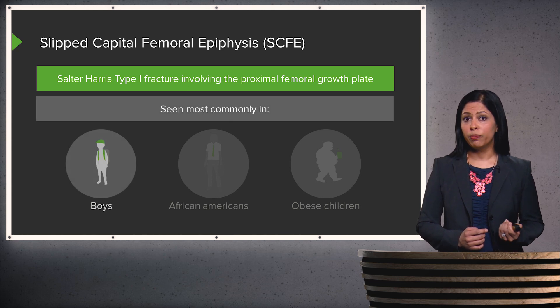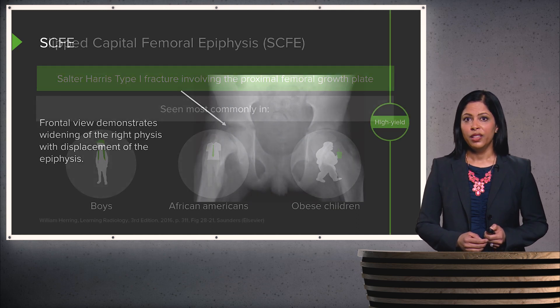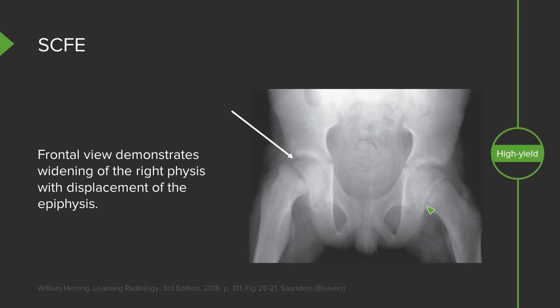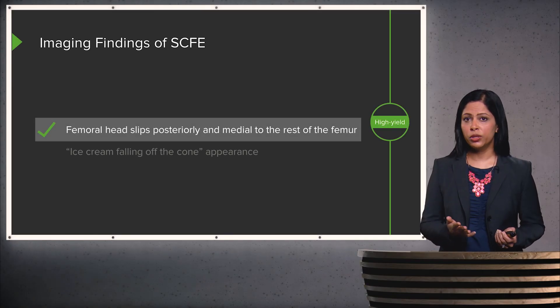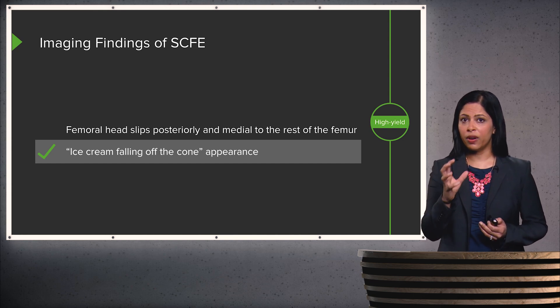SCFE is seen most commonly in boys that are African American and also commonly in obese children. The frontal view demonstrates widening of the right physis — comparing right versus left, the right is significantly wider. It also results in displacement of the epiphysis, which has been displaced medially compared to the left. This occurs when the femoral head slips posterior and medial to the rest of the femur, likened to ice cream falling off of a cone, where the epiphysis is the ice cream falling off medially.